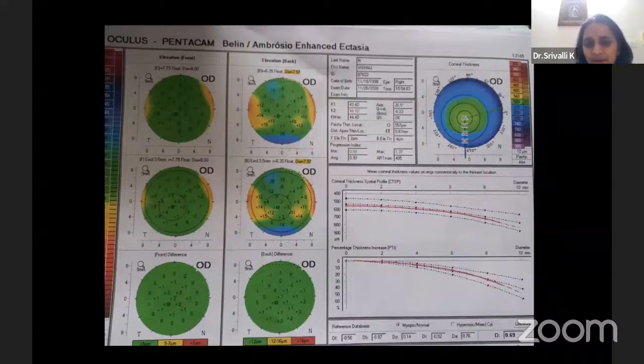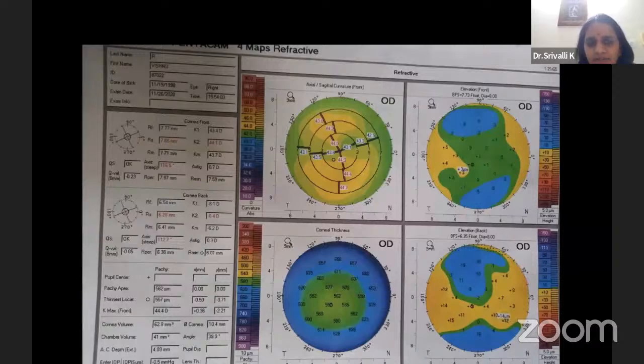I just wanted to say, along with all the things ma'am has said, can you go one slide back? When all of you are starting, please make sure that you look at the date of birth which has been entered there, and then see the age of the patient, because all these normalized values are compared with the normal of those age groups. Whenever you are reading out a quad map in an exam, it also gives you a little more time.